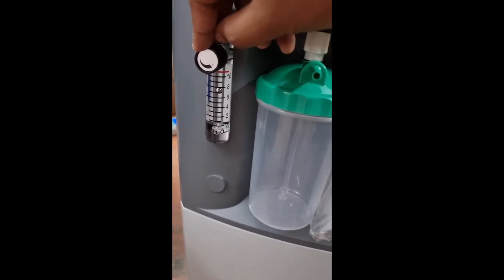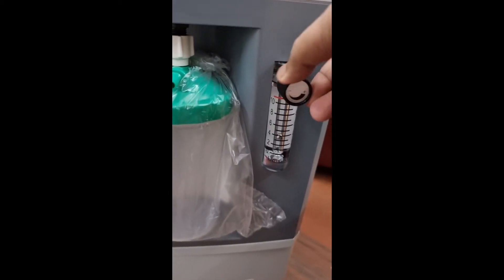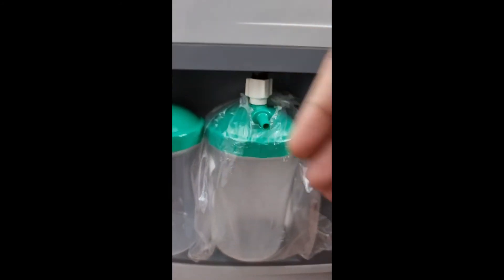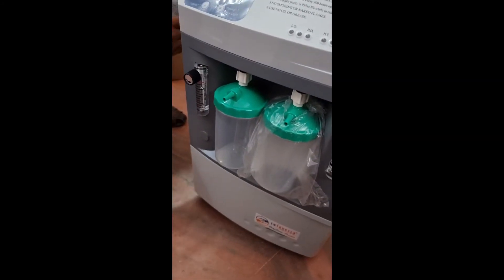If you are going to keep one side at 2, we have to keep the other at 8. Now I have set it in dual flow mode — 8 and 2. After some time we will attach the oxygen analyzer and check both outlets.